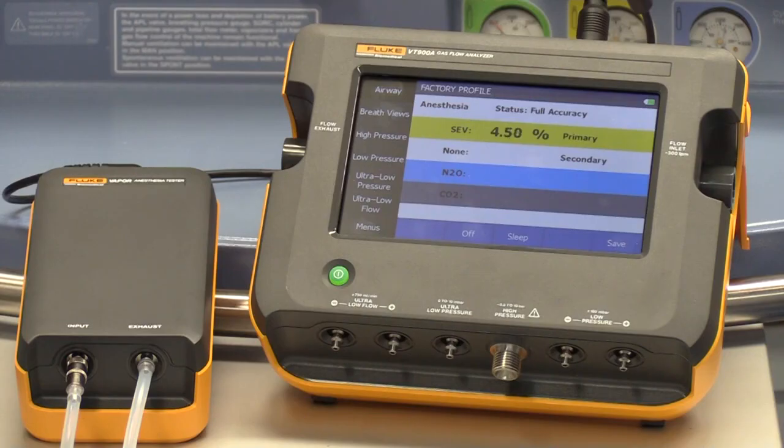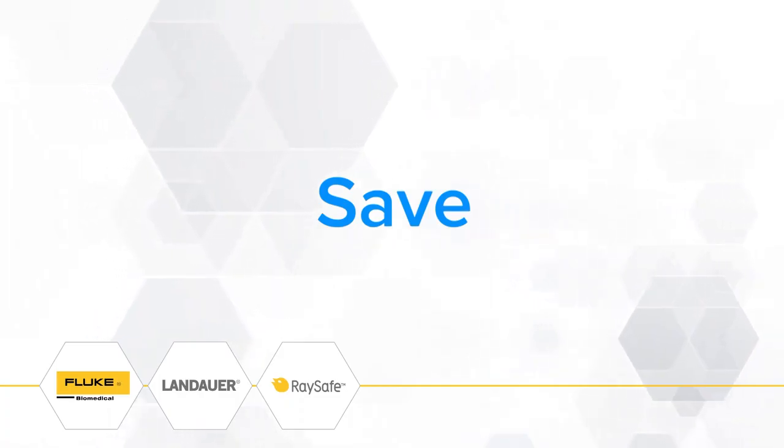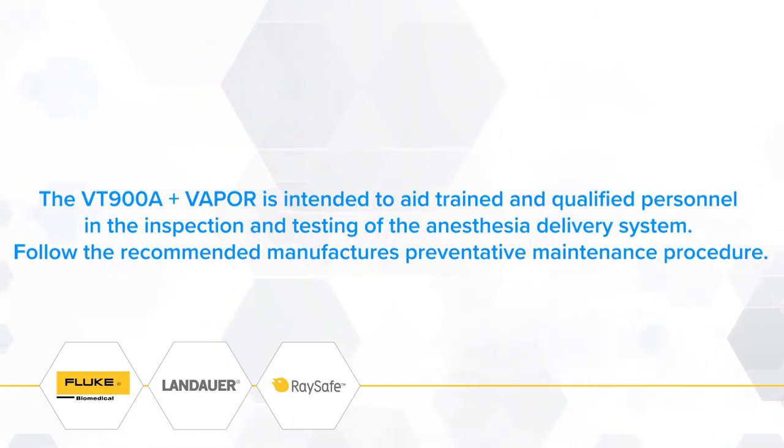The reading on the vaporizer rotometer should match the reading on vapor within acceptable tolerances. This procedure should be repeated for all flow and concentration test points listed in the service manual. We can save the information on our tester at any time by pressing Save at the bottom of our screen and then selecting Data, Recording, or New Test ID. Vaporizer testing is now complete.